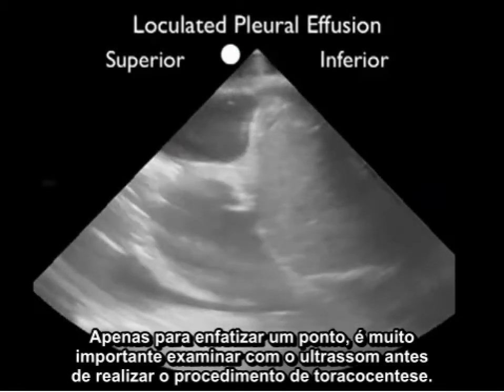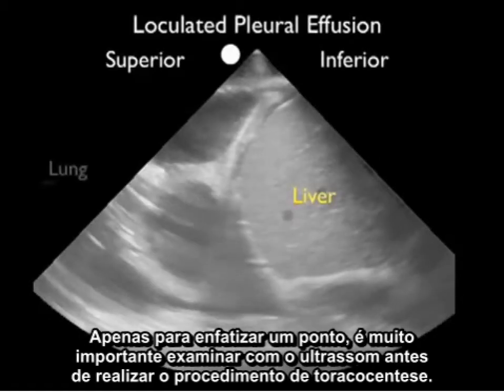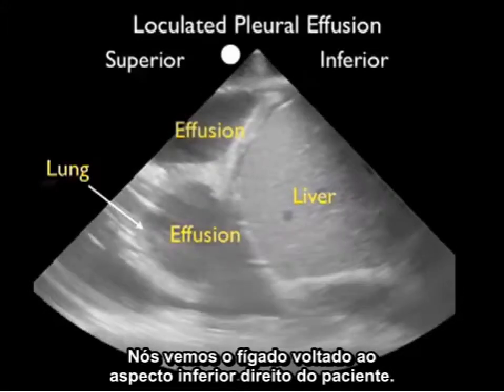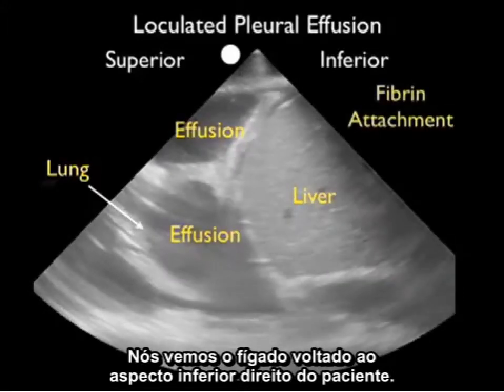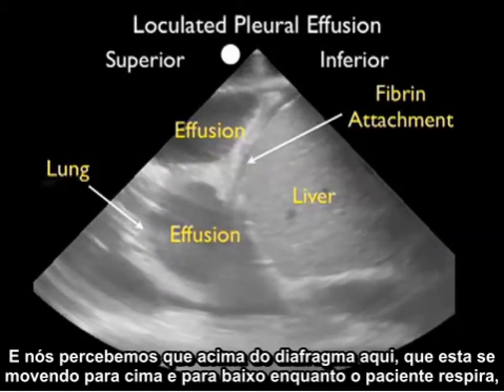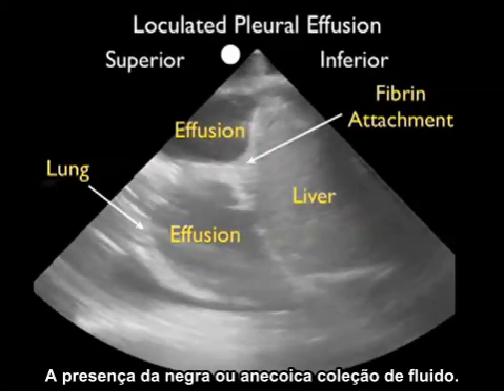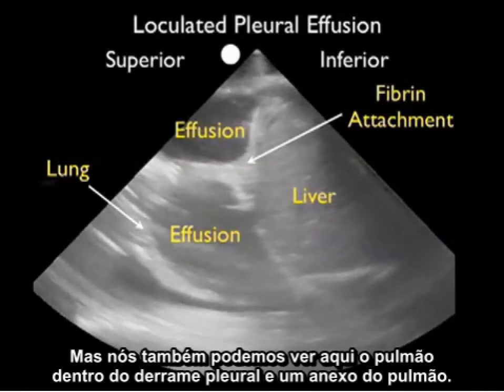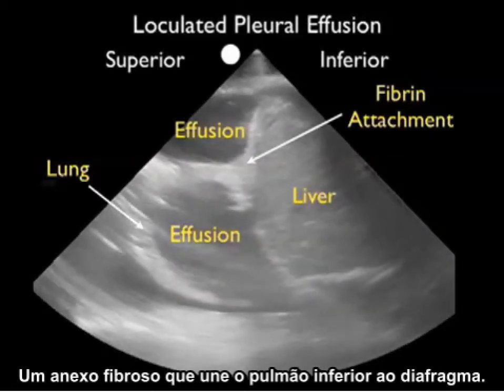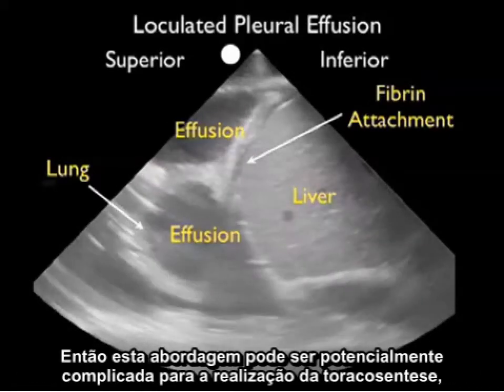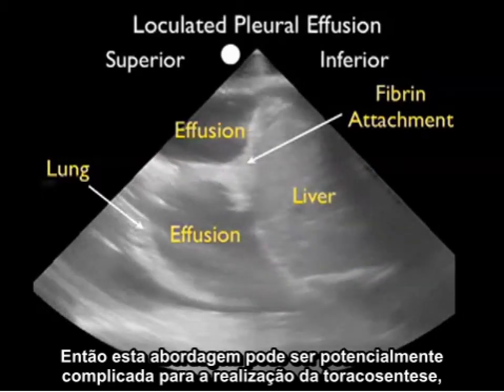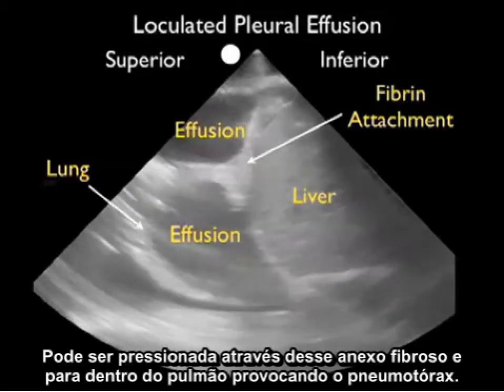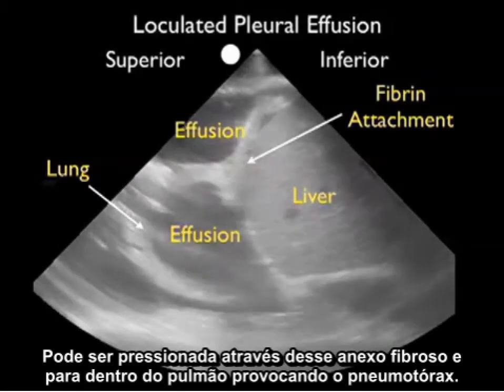To emphasize the importance of looking with sonography prior to thoracentesis, this pleural effusion is taken from the right chest. We see the liver towards the inferior aspect and note above the diaphragm, which is moving up and down as the patient breathes, the presence of a dark or anechoic fluid collection. However, we also see lung within the pleural effusion and a fibrinous attachment that attaches the lung down to the diaphragm. This could be a complicated thoracentesis, as a needle entering that chest cavity could be pushed by that fibrinous attachment up into the lung, causing a pneumothorax.